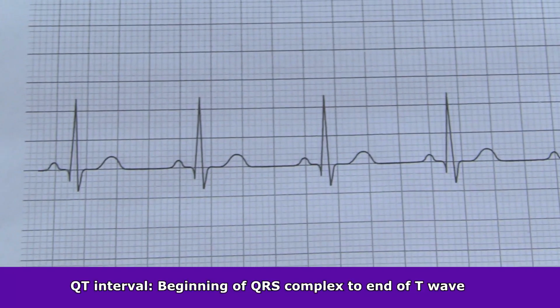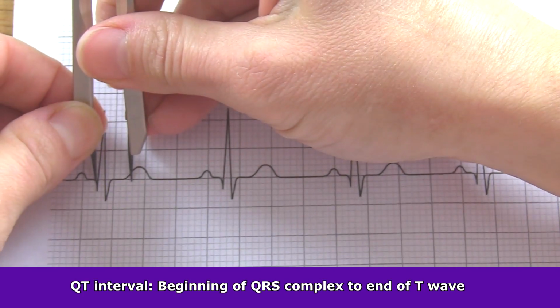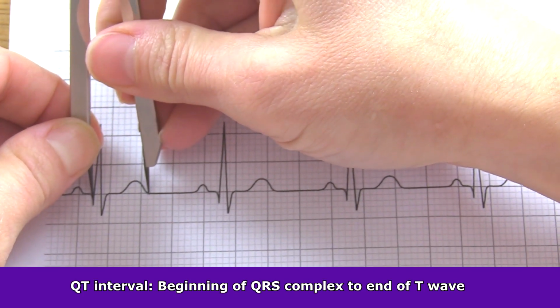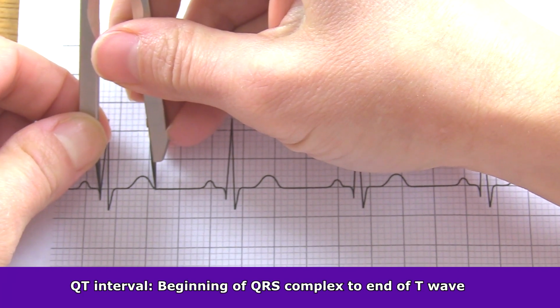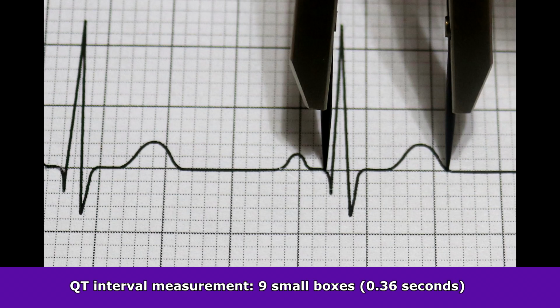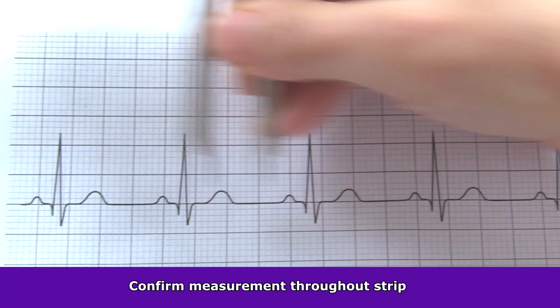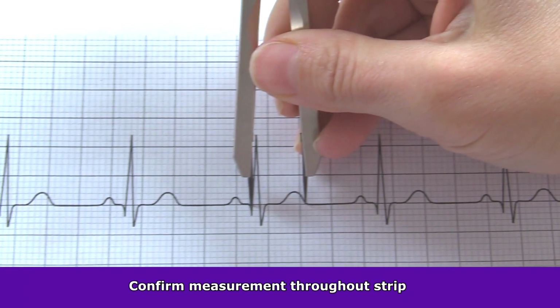Then you want to take a look at the QT interval, which is found from the beginning of the QRS complex to the end of the T wave, and you just want to count the boxes from there to there. Here we have about 9 boxes, so that gives us 0.36 seconds. And just track that down all throughout the strip and confirm you have that throughout.